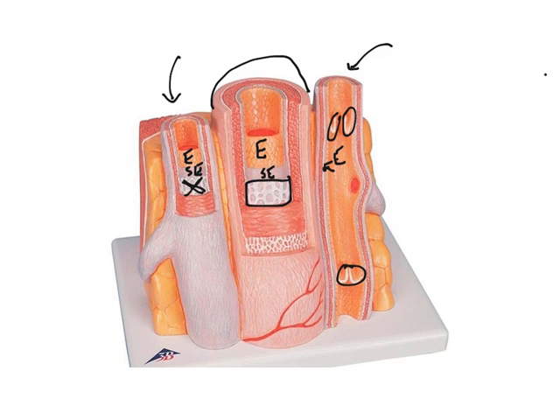The next distinct layer that we have in arteries and veins is called the tunica media. The tunica media is going to have some smooth muscle, and so this, I'm just going to put SM, so you get smooth muscle. Arteries will have more smooth muscle than veins. The tunica media does also include some collagen fibers.